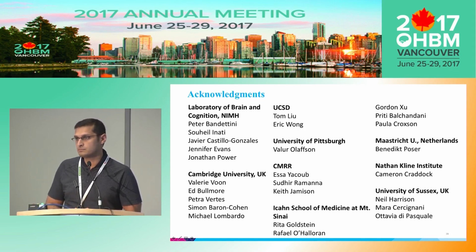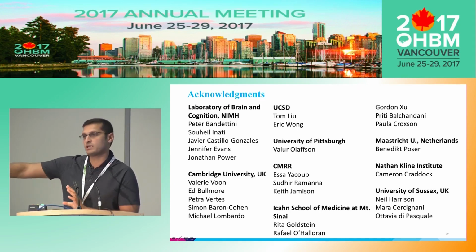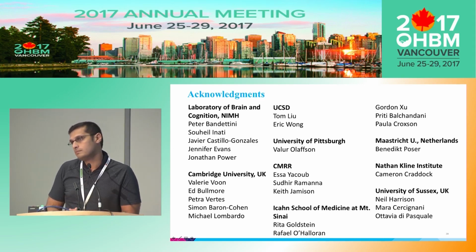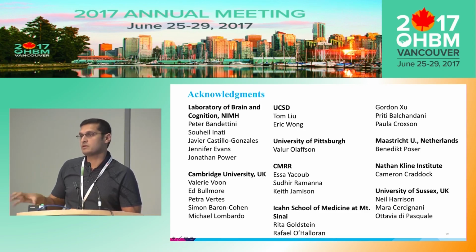So you don't see those at all? They're not included. They're non-BOLD, so they're not included in the BOLD time series. We just project out the entire non-BOLD space. Okay, maybe I misunderstood because I thought you ran ICA after separating the time series. No, the ICA was applied on the raw data, and then we used the non-BOLD components to project them out.